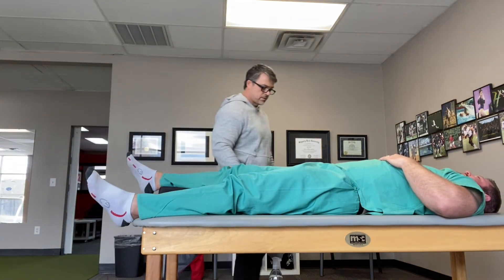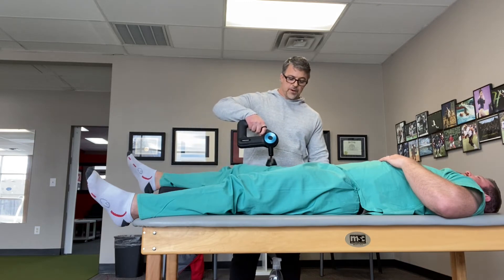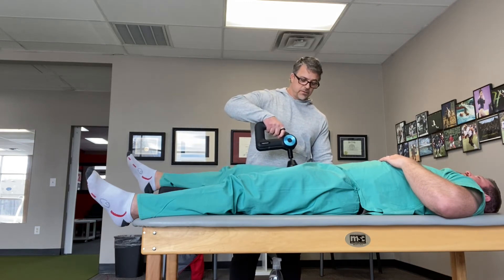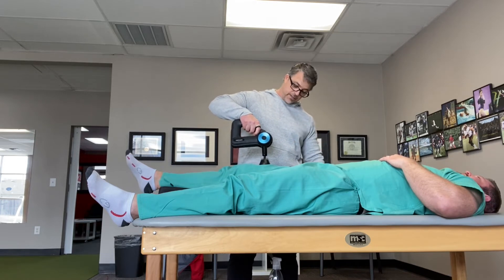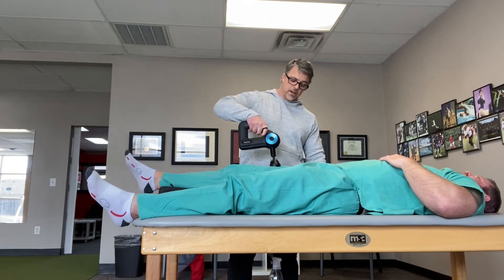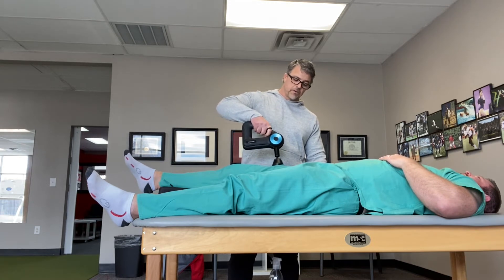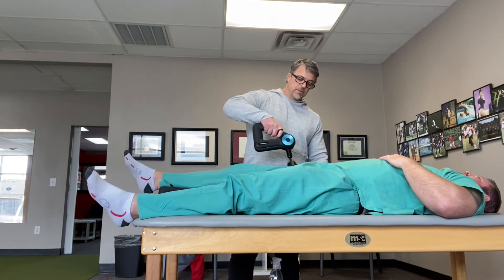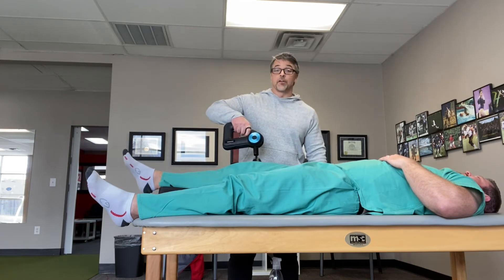So now we're just going to use this guy. There's only one setting, and I'm not going to give him a bunch of pressure — I'm just kind of letting it float, do its job. We're going to go about 30 seconds. So think about this: if you're somebody who does Theragun, why do you do it? What's the effect you're looking for, and what do you think the physiological effects are — or has that even crossed your mind?